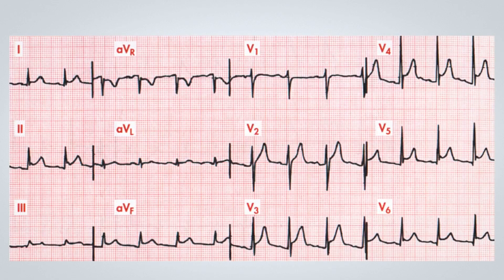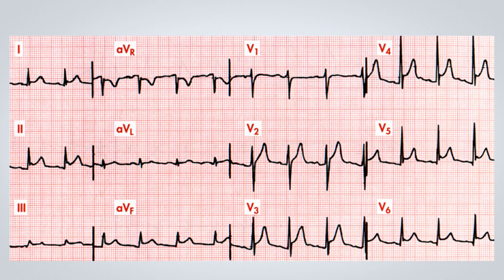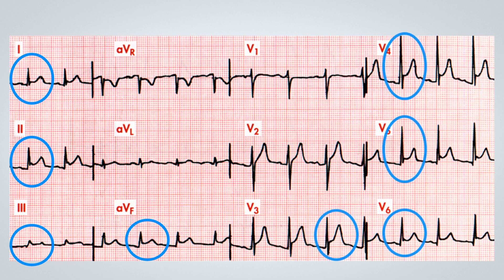Returning to the first tracing for discussion, we can observe a sinus rhythm with no alterations in the QRS complex axis and the QRS complex itself. Upon examining the ST segment, we can see an elevation of the ST segment in nearly all leads, most prominently in D1, D2, D3, aVF, and from V3 to V6.